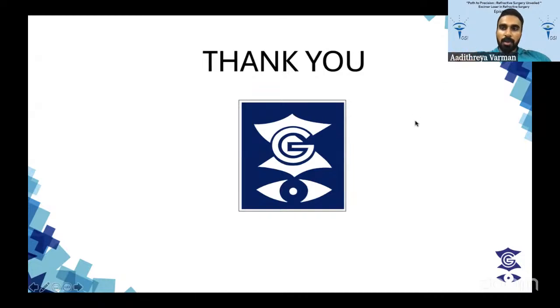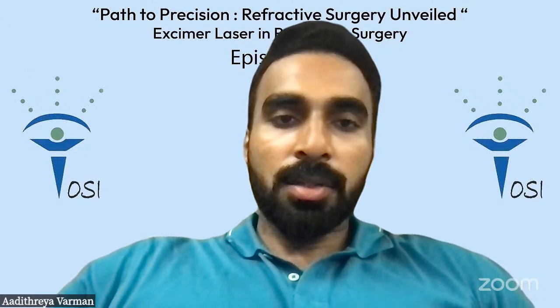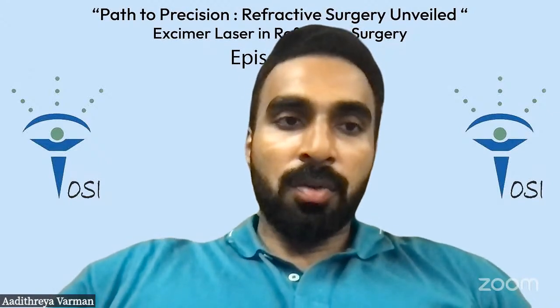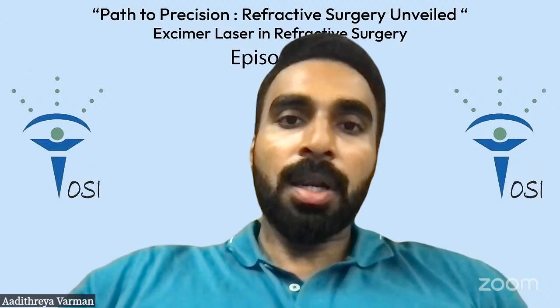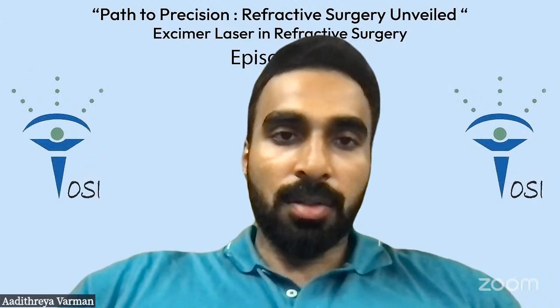The whole concept of Presbyon is extending your depth of field. So you don't just extend depth of field in your non-dominant eye alone. It works on the dominant eye also. So for that very reason, even if the dominant eye has a very minuscule refractive error, even if it is half a diopter, we treat the dominant eye also to induce the required amount of spherical aberration to extend depth of field. Whether it is positive or negative, the target spherical aberration is between 0.3 to 0.6. That's what gives you the depth of field without degrading quality of vision. So you need that 0.3 to 0.6 in the dominant eye and the 0.3 to 0.6 in the non-dominant eye.